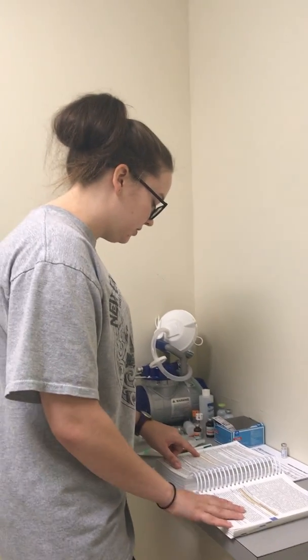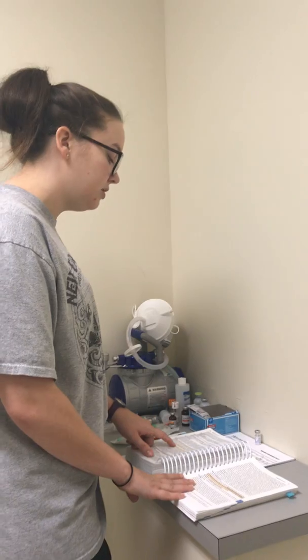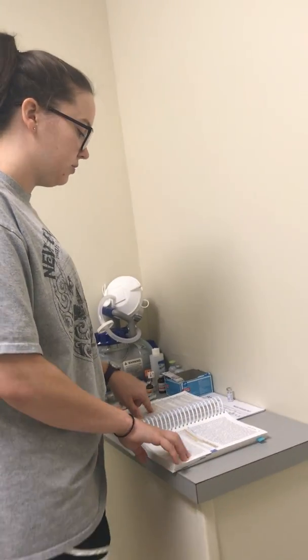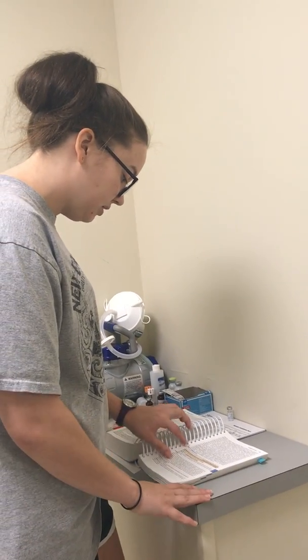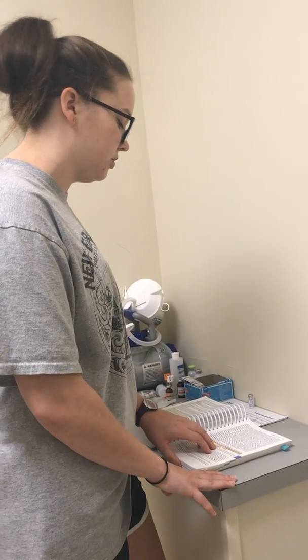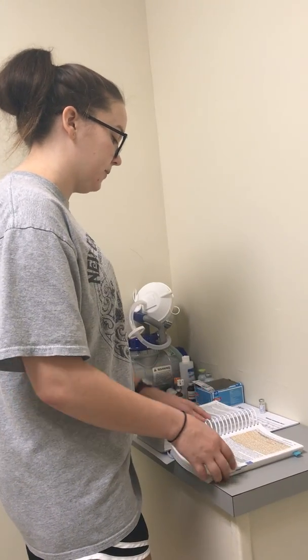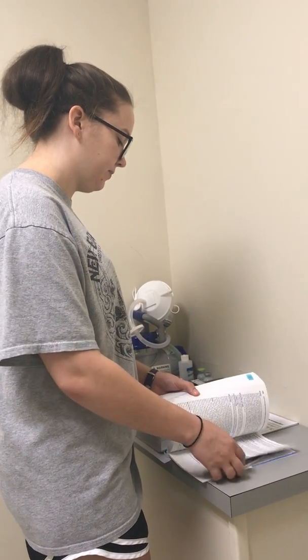My dilution is for an IV injection. It says it may be given undiluted, so we will not be adding anything to our medicine. The rate of administration for an IV injection is a single dose over 4 to 5 minutes, which I would choose 5 minutes for the longer amount of time.